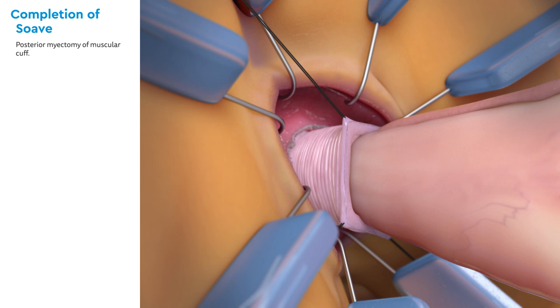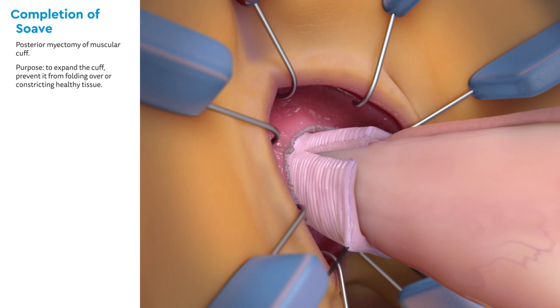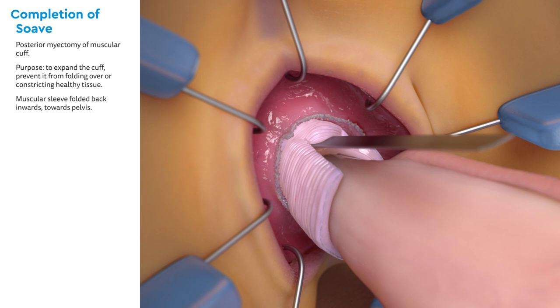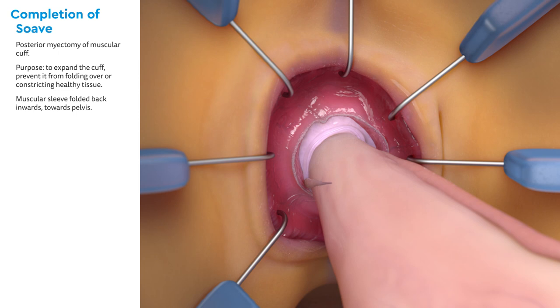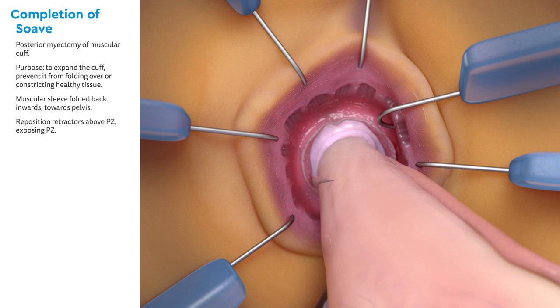Next, a posterior myectomy of the muscular cuff is made. Its purpose is to expand the diameter of the cuff, thereby preventing it from folding over or constricting the colon used for the pull-through. The traction sutures are removed and the cuff is folded back inwards towards the pelvis. Next, the retractors are repositioned above, or distal to, the pectinate zone to visualize the whole anal canal and distal rectum for the colorectal anastomosis.